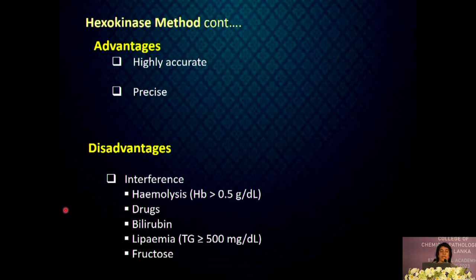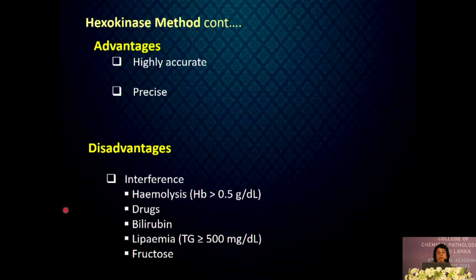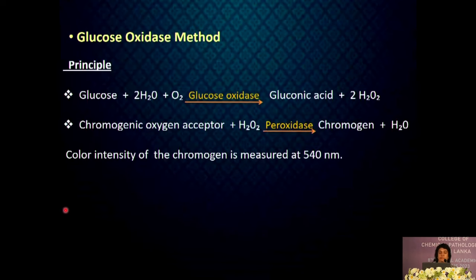The hexokinase method is highly accurate and precise. Among its disadvantages, it can be interfered by many substances. Hemolyzed samples are unacceptable because phosphate esters and enzymes released from red cells will interfere with the assay. Other sources of interference are drugs, bilirubin, lipemia and fructose. In a fasting sample, fructose concentration is minimal, so fructose interference is not a problem.